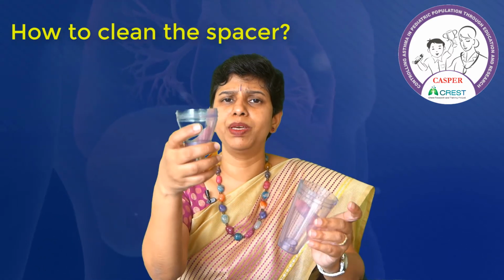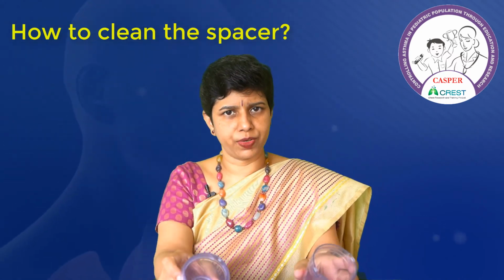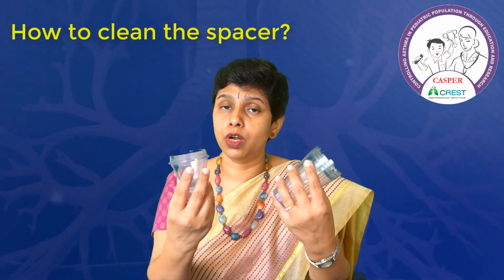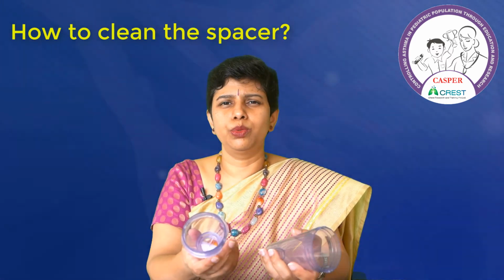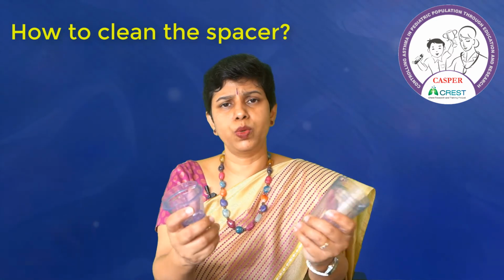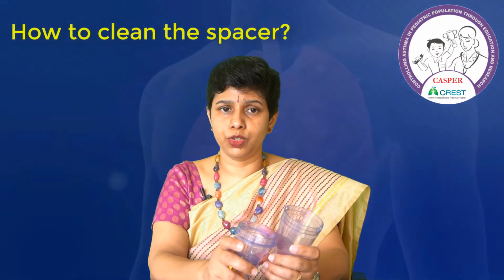The spacer has to be washed at least once a week. It should be held under running tap water. Just rinse it under running tap water, shake it and leave it for air drying. It's best not to wipe it from inside, and it's very important that it is not boiled. If at all you have to use a detergent, a mild detergent may be used, otherwise it is not required. Just wash it under running tap water, rinse it and keep it for air drying. Once a week it is important to do this.